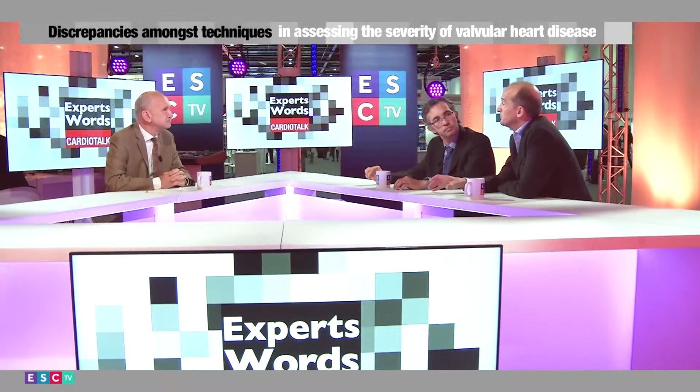Okay, if I could ask you about the next problem, about multivalve disease, because again, this is increasingly common as our population ages. How do we resolve that? Well, in multivalvular disease, it's extremely important to know the shortcomings and the caveats of echocardiography. When you have certain combinations of valvulopathies, sometimes one measurement, you cannot use it anymore. It's not a problem if you know it, of course, and if you take that into account. Now that can bring you into a situation where you don't have 3 or 4 numbers that can help you, but only one. That means that if you have other techniques that can help you to be more confident, you have to use them.